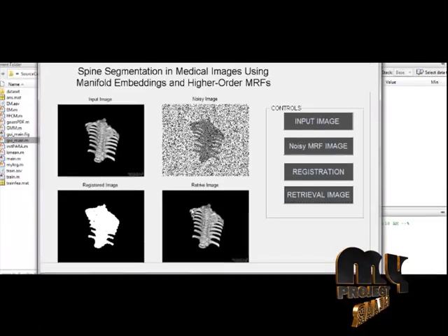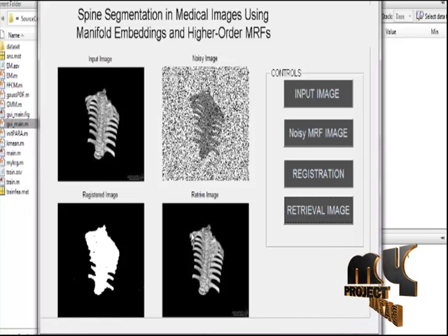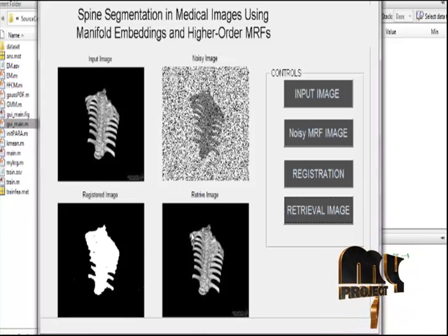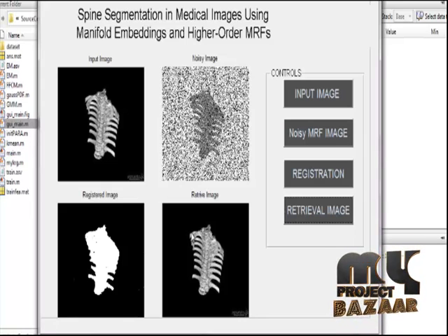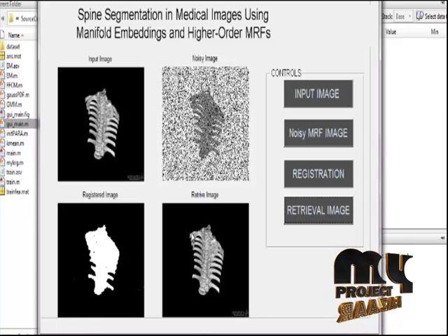We have to calculate the distance values between the 2D spine input images and the trained values. From those values, we compare and find the minimum values, and check the perfect match to the original images in the database. Finally, those perfectly matched outputs from the segmented images have their performance measured.